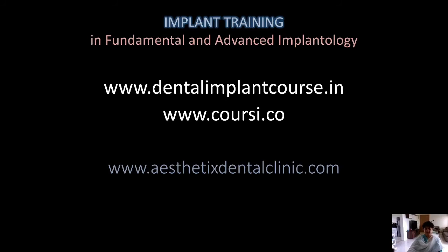And that is a bone which is in a mineralized form, so the non-organic content of the bone is preserved. All the collagen, all the cells, everything is removed, so there's no chance of cross-immunity. And I've been using this bone since 2001, as I joined Yale University, we started using it. Initially, it was very difficult to get it here, but now it's available in India.